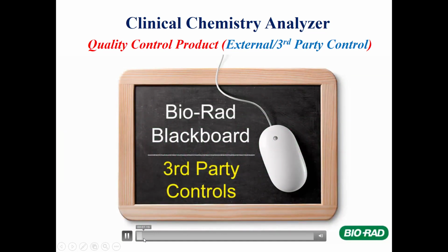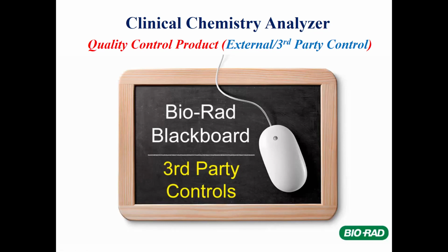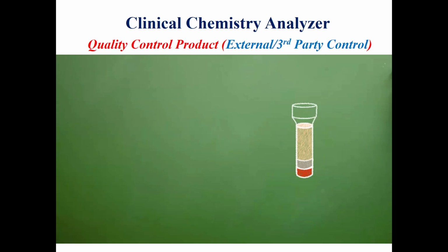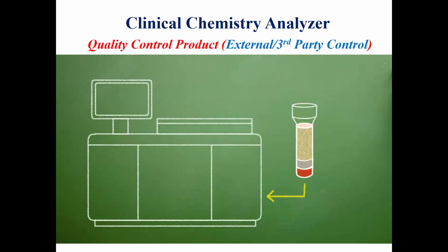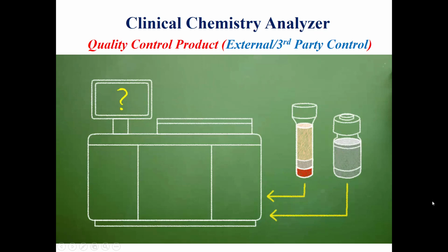Welcome to Biorad's Blackboard training. This is a series of short, informal tutorials brought to you by industry experts. Today we'll introduce the concept of third-party controls. The testing process begins with a patient specimen. The specimen is sent to the lab for testing. How do we know that the results from the testing process are valid? While running patient samples, labs also run samples of a known value. These are commonly called controls or QC. Controls allow the laboratory to monitor its testing systems and eliminate errors that would impact patient results.